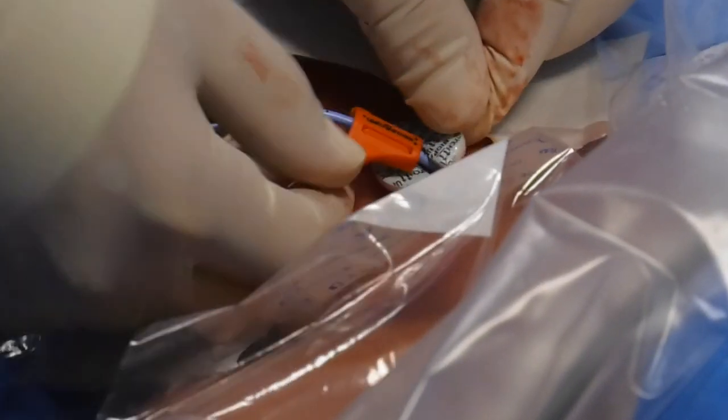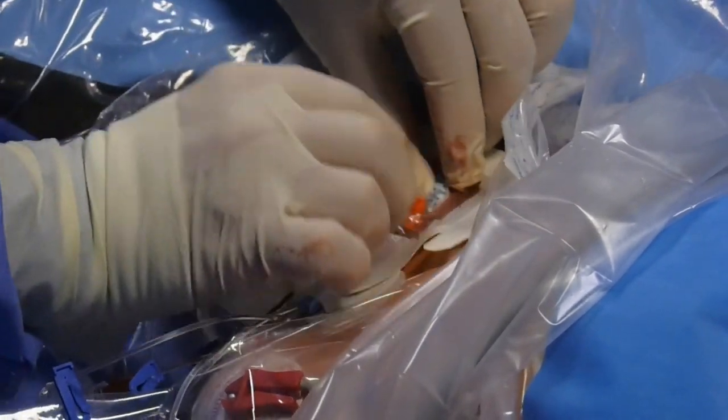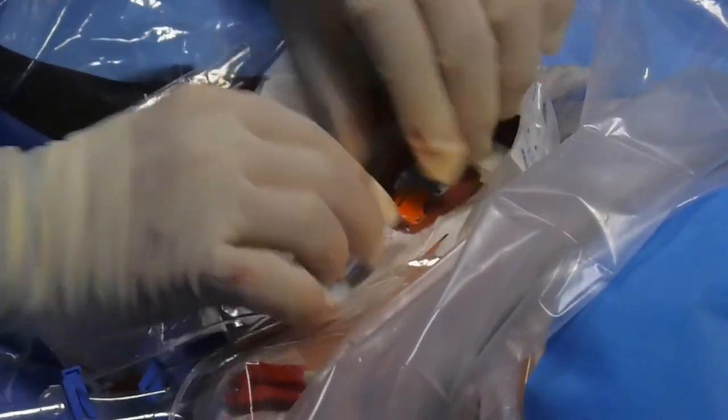Dress the catheter site. Do not turn or twist the SecuraCath from its original position. Only the extension tube should be outside the transparent dressing.